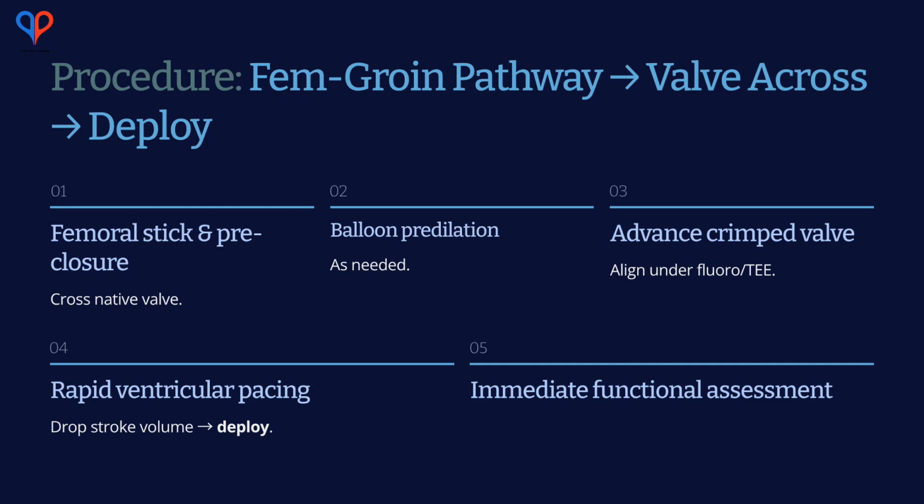After deployment, valve function is assessed by injecting contrast dye to confirm proper seating and to ensure there is no paravalvular or transvalvular regurgitation. We will expand on this in the next few slides.